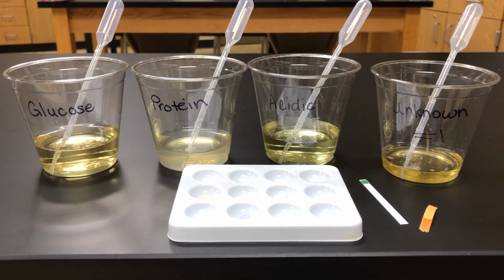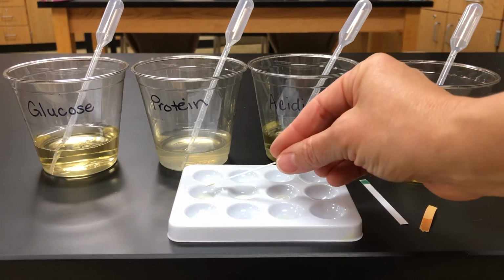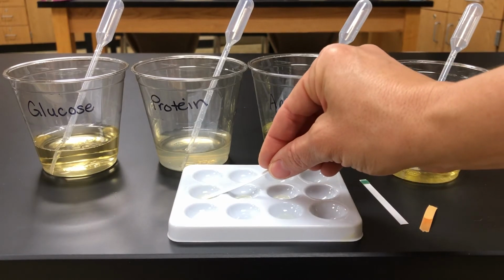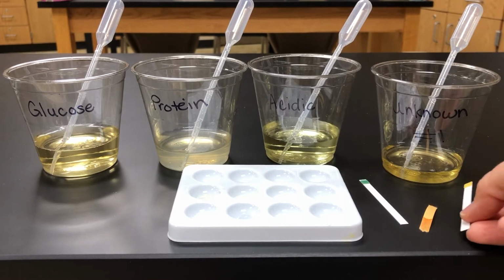Okay, now we need to test. A was glucose, so we're going to grab another glucose strip. Okay, here's our glucose strip. We'll place that in the solution, 2 seconds. Drip off the excess, and we'll let that sit.